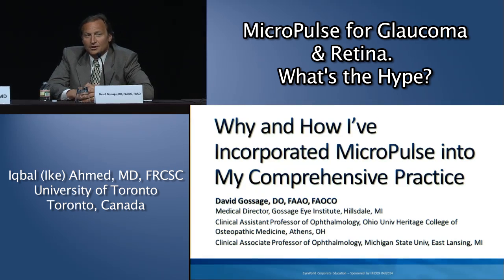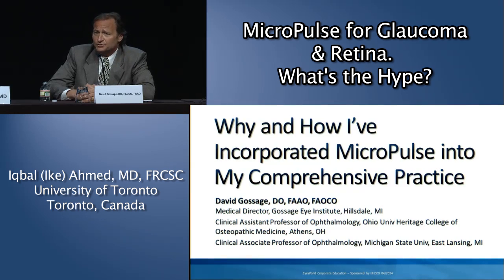We've been doing MLT for 2.5 years now. Some of my earlier patients who were treated with a lesser power have been retreated using the 1,000 milliwatts instead of the 300 or 700, and I still got a nice effect. I know one patient with pressures of like 27 initially, treated with the 700 milliwatts, brought it down to 22, and then I hit the patient again with 1,000 milliwatts later and brought the pressure down to 18. So you can still see added effects.